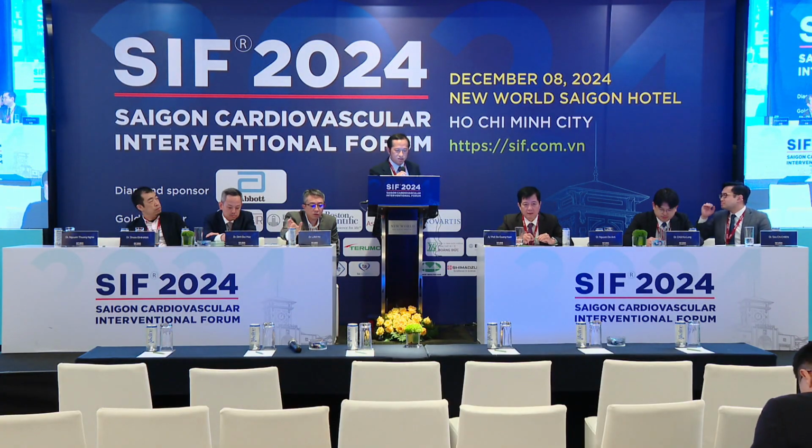Yeah, because when the stenosis of the ostium of the side branch is 90%, normally we will lose the side branch. And if we do the kissing balloon technique first before we put the stent in the main branch, we avoid jailing the balloon in the side branch. Yes. So thank you for your question.